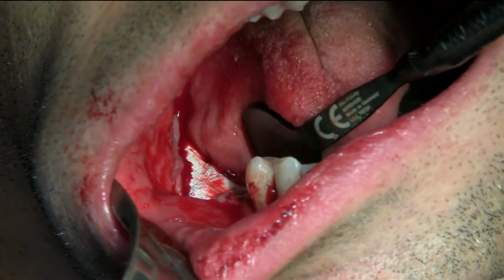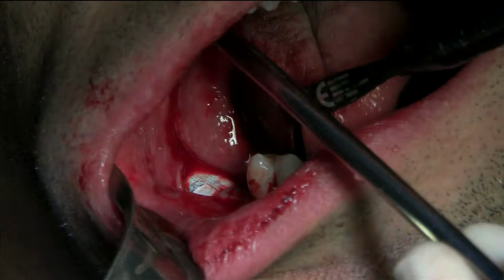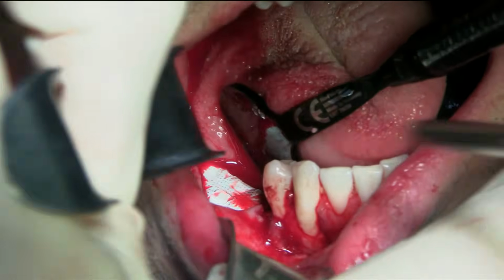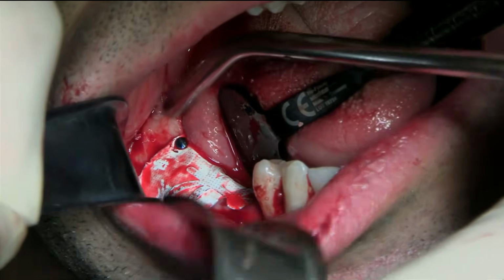Okay. And yeah. Just wash. And let's place the collagen membrane. So I need a retractor in the back. Right here.